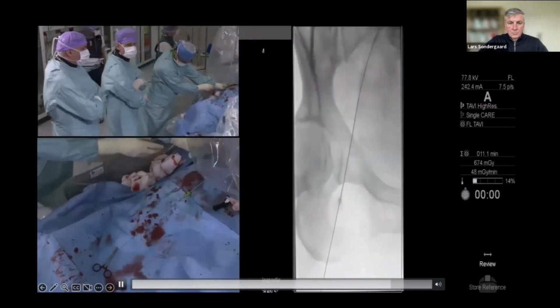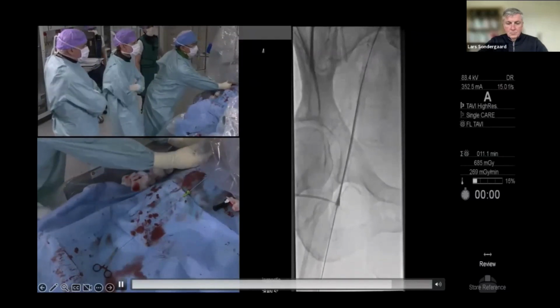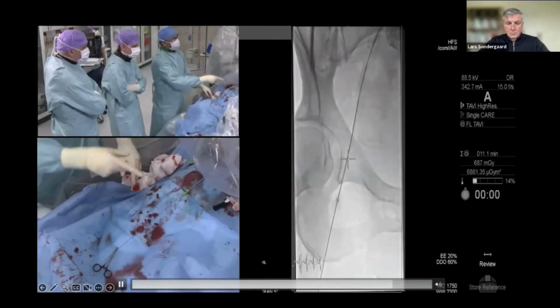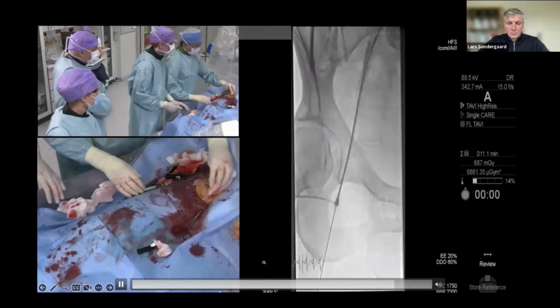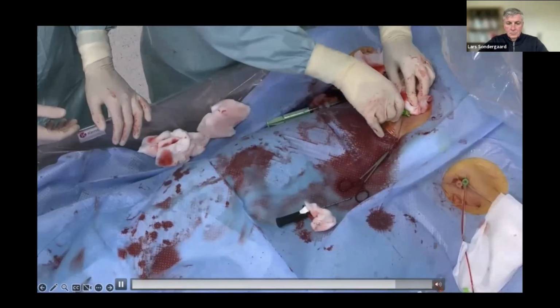That's good. So that's where the 6-French sheath or the stiff guide wire dilator went out. Yeah, so it's a good flow. There's, of course, 2 ProGlides. They cause a little bit of pinching, but very fast flow. There's clearly no stenosis there at all. So we can remove the 6-French sheath and finalize the closure of the ProGlides. We'll see how it looks like. Let's keep the wire for now. Sure. If there would be bleeding, then we can easily just put the AngioSeal.